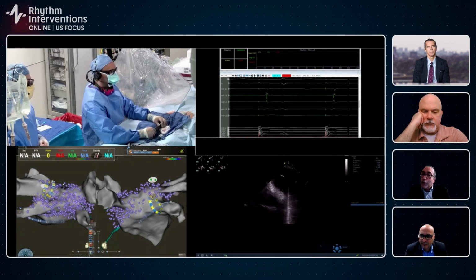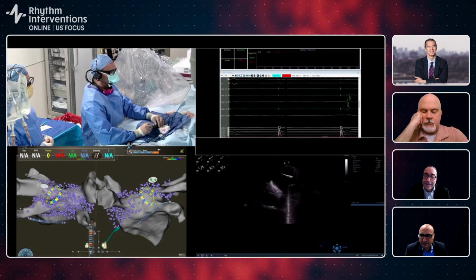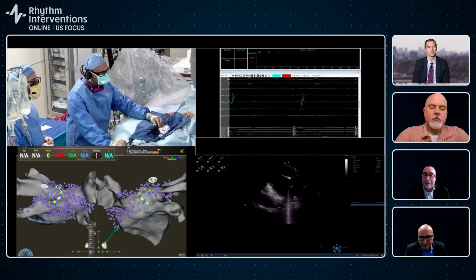Well, it's not too strong. But aside from pacing, yeah, if you really wanted to, you could pace from in the atrium.